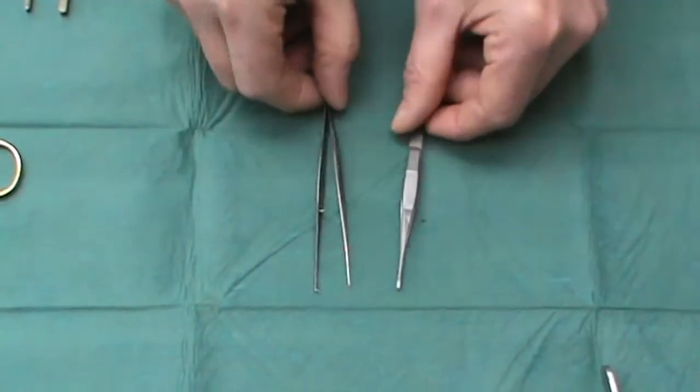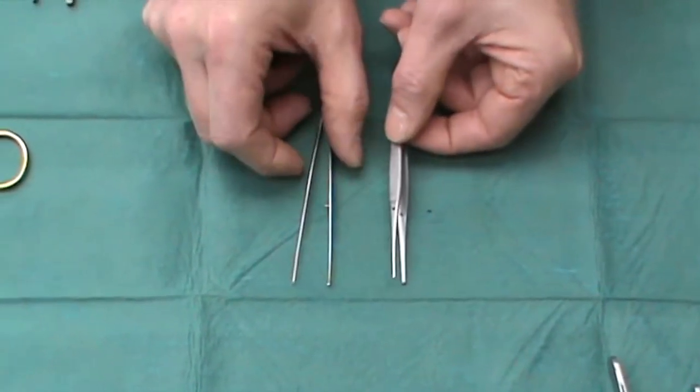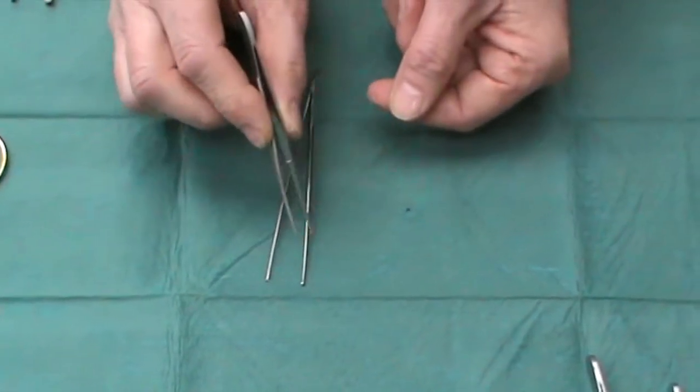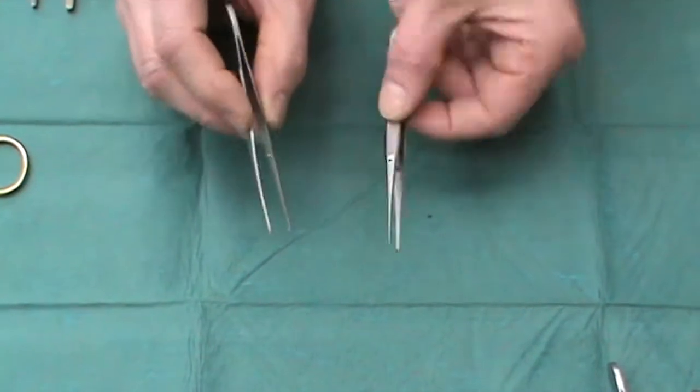You may see these smaller instruments in some disposable sets. Personally I find them too small to use for ordinary skin surgery. I think they'd be fine for operating around the eye, but not really on the skin — they're too small.